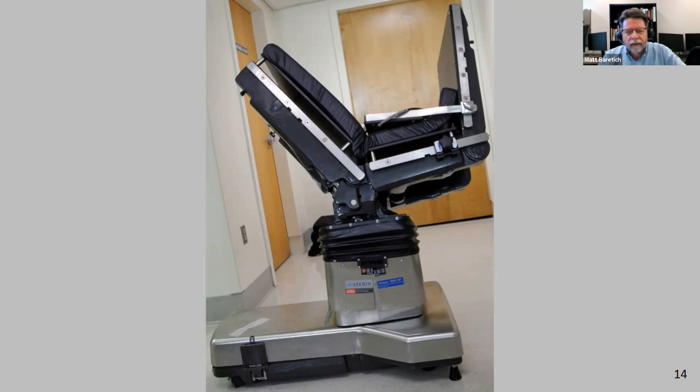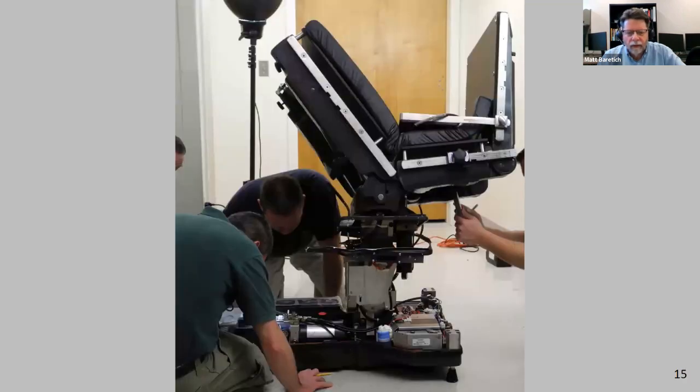But as you can imagine, this turned into a lawsuit. And so there was a long investigation that had several parties, and this is just the one photo I want to show you. I was one of a number of engineers who were doing the investigation, where essentially we took this apart. And at every stage, we took pictures and videos and talked to each other and wrote notes. And we also took some electrical measurements of voltages and pressures along the way, and it can become quite involved. This was several hours of work.